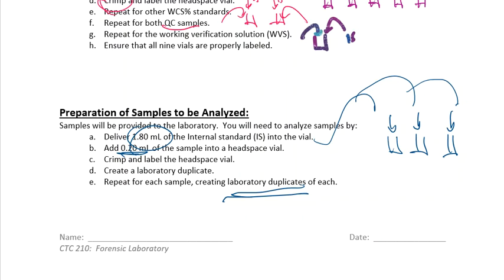So that's the preparation of the samples. They will be real blood. Make sure that you wear gloves and treat everything accordingly.